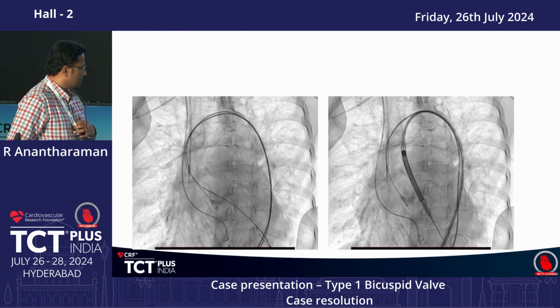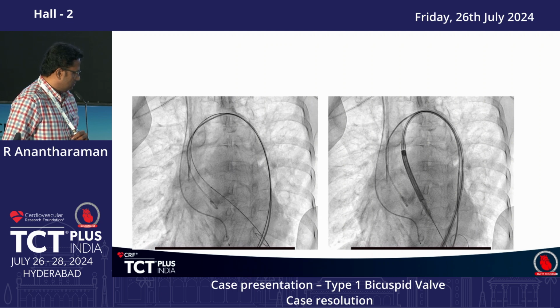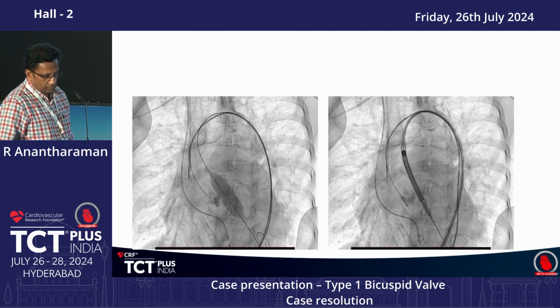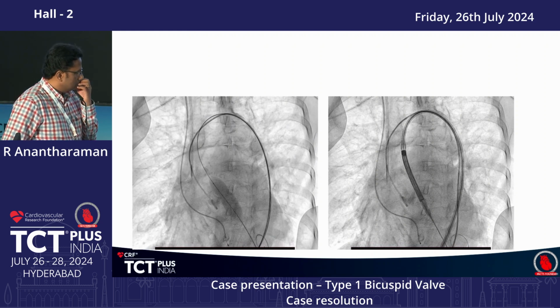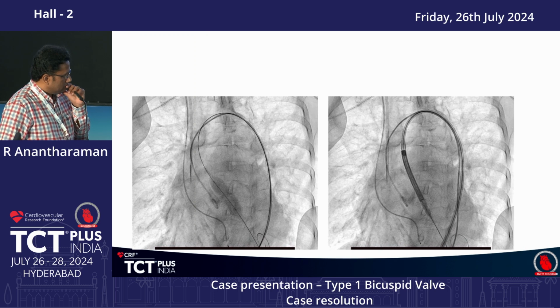Yeah, so Ravinder was going to say something. When I'm dealing with bicuspid valves, I always choose not the mean of the annular dimension diameters, not the minimum diameter. And this is exactly what, but in such cases in the past, we have upfront taken a Lundquist wire because when you have a right and non-fusion, the entry is very eccentric. At the level of the annular plane, you can use snares, multiple things to bring the valve on top of the opening. But first thing is you push a little harder and see if you can get into it and try pulling the wire at the same time. But don't push too hard. You don't want to damage that nose cone.